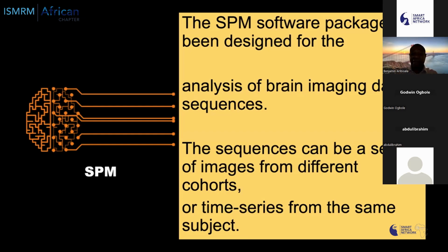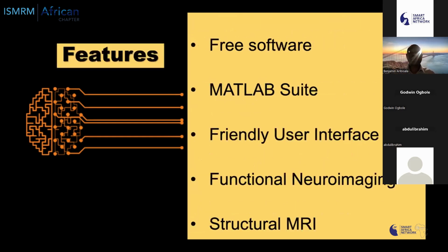So that's SPM, developed by the team at UCL, University College London. SPM runs in MATLAB, or on MATLAB, so you need a knowledge of MATLAB to use SPM.